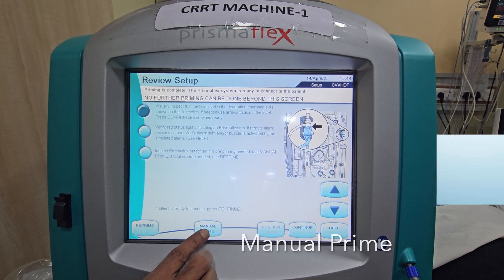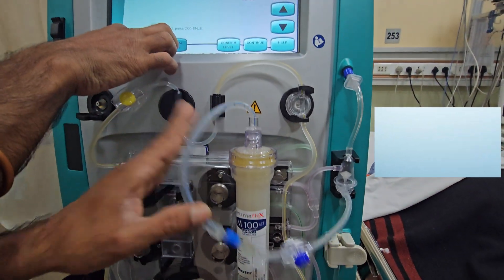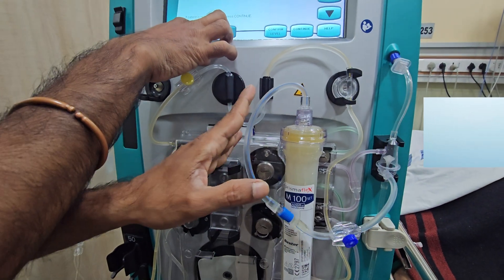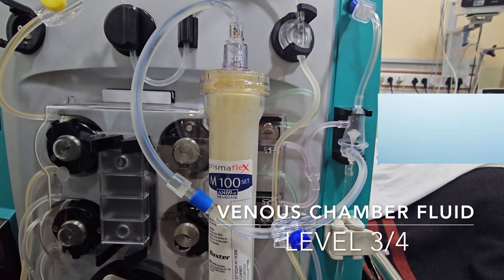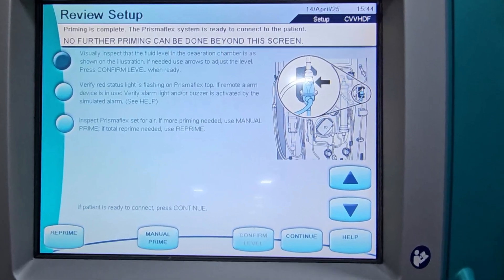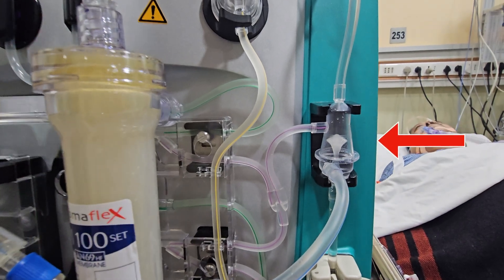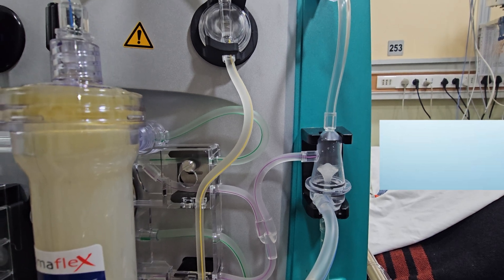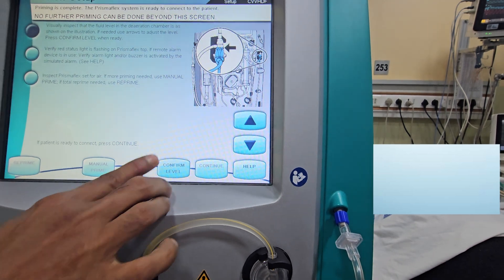Manual prime is pressed. Fluid level in the deaeration venous chamber is adjusted to the three-quarter level by pressing the knob. Confirm level.